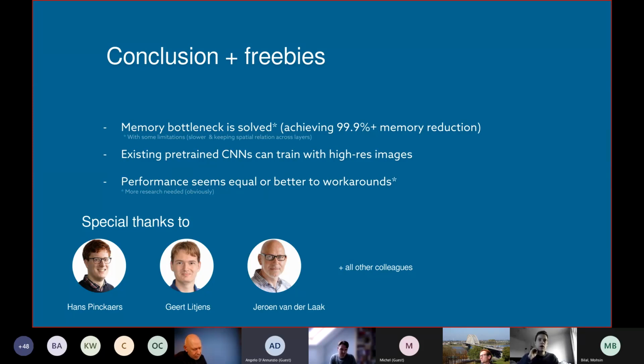I don't exactly know under the hood how it works, but there is a solution that's based on building a pipeline. It's called PyVips, and I don't know exactly how they do it, but it scales really well with multiprocessing. It scales really well in terms of memory. And even at training on 65K, I'm able to do augmentations quite well, and streaming, so training the network itself, turns out to be the main bottleneck.